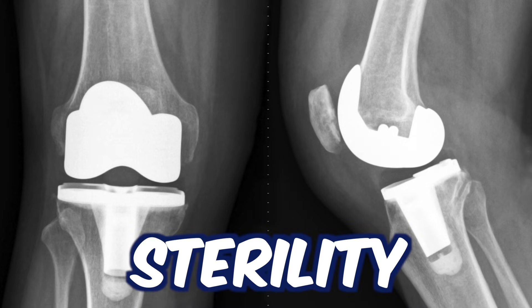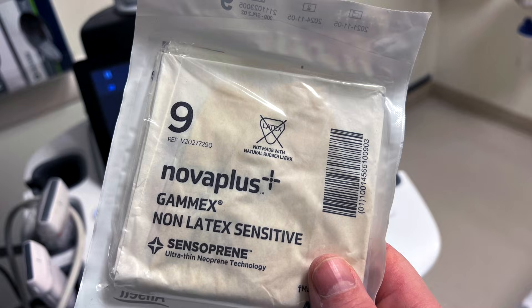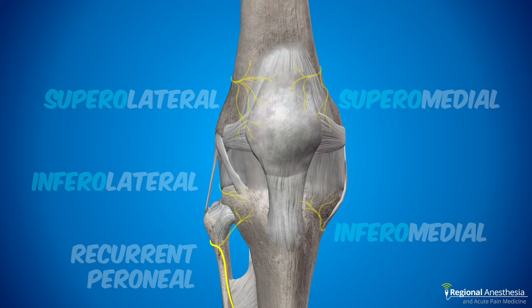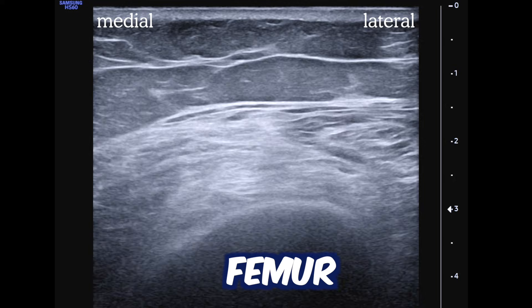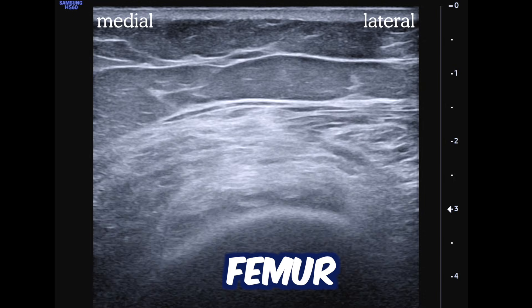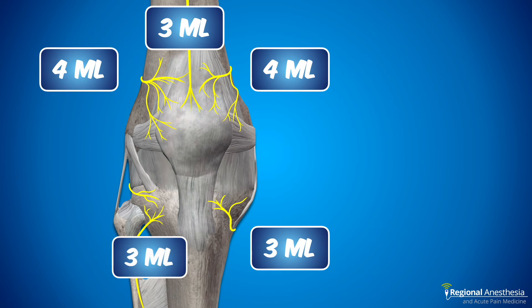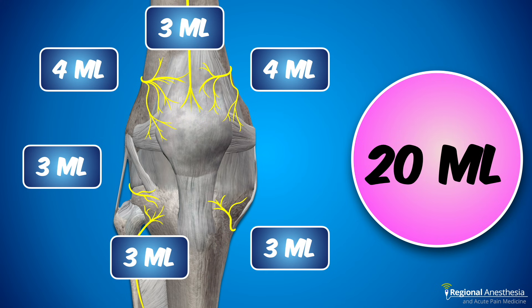Because we're doing these close to the joint, we are super attentive to sterile technique — use a probe cover, sterile gloves, and lots of skin prep to avoid risk of joint infection. Finally, while we're in the vicinity, we also block the nerve to vastus intermedius just above the knee. It lies in a reliable location running along the anterior surface of the femoral shaft, and it's easy to target while you're doing the geniculars. Bring the needle down out of plane and place the usual 3-4 mils there. That's a total of 6 injections of 3-4 mils, so one 20 ml syringe of local anesthetic is absolutely sufficient.